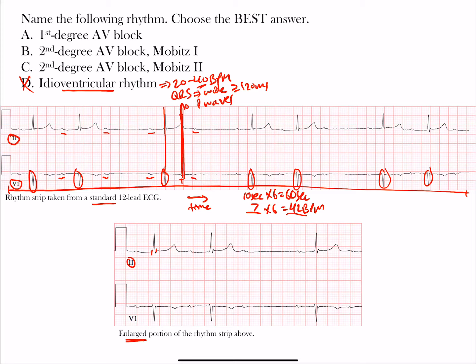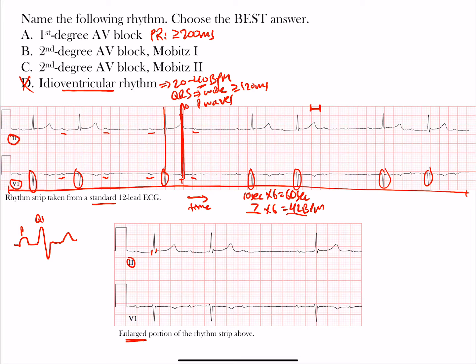Now let's look at first degree AV block. This is when the PR interval is prolonged — greater than or equal to 200 milliseconds, which is five small boxes or one large box. From the beginning of the P wave all the way to the start of the QRS is 200 milliseconds, so if the PR interval is beyond that we consider it prolonged. The PR interval goes from here to here; the PR segment is the portion after that.